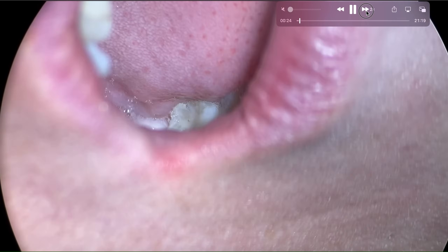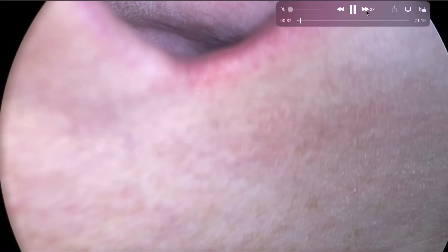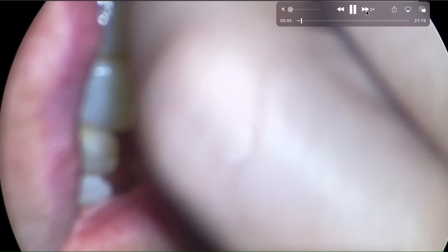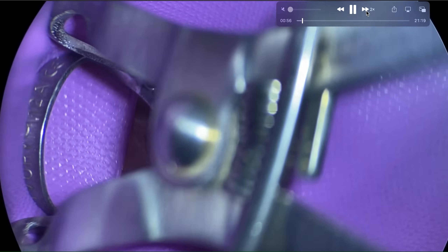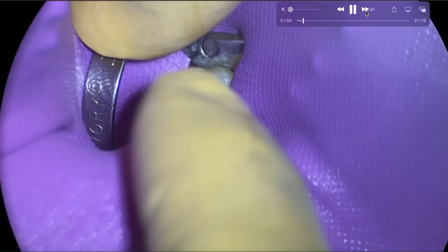I have some sectioning that didn't go according to plan, so we can watch about things that we change — a couple tips here and there — just from taking thousands of teeth out. So let's go ahead and take this tooth number 4-6. It's an endodontically treated tooth, and it's important to learn how to section, or plan, and have a strategy before you start extracting teeth.